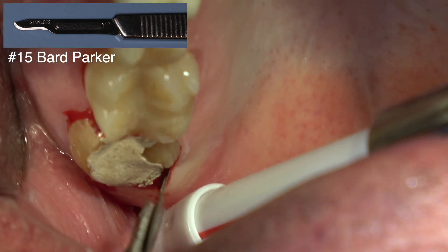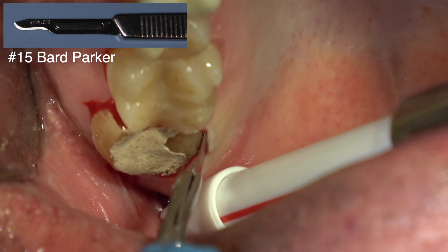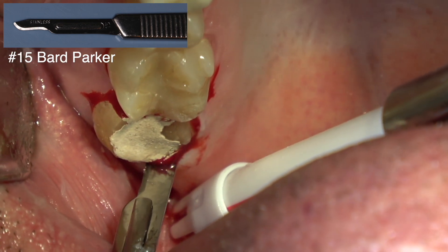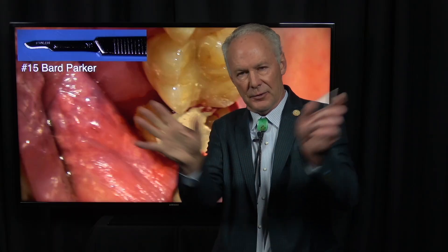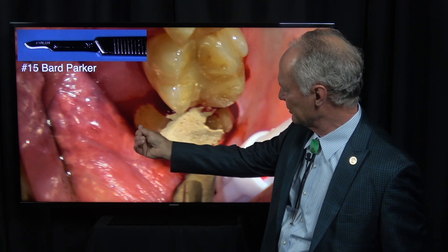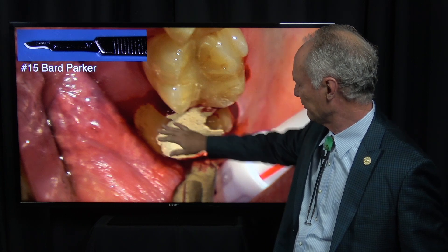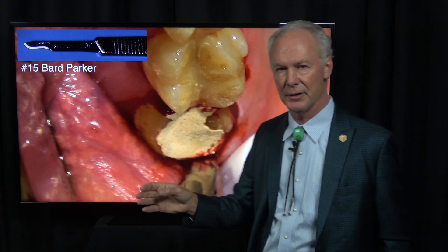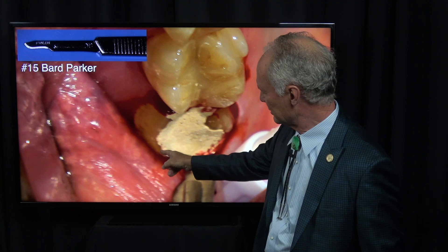Now what happens if you try to extract this tooth in one piece — a single tooth extraction? Those roots go in this direction, so if you try to do that, you're going to have to extract it to the facial and you're going to lose the whole facial bony plate. So I'm going to extract this tooth in three parts: we've got a palatal root, a mesial buccal, and a distal buccal root.